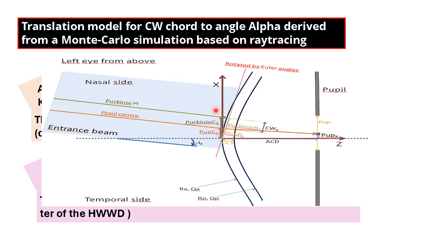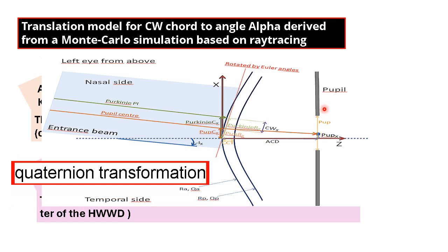After establishing the y and x coordinates, by special mathematical calculations known as quaternion transformations, he measured the exact distance between the visual axis and the pupillary axis, which is called the chord mu. This is the chord mu. This is the exact location, the one that we are looking for. This schematic model is just to measure this value, so it gives a very precise and accurate measurement of the chord mu at the iris plane.